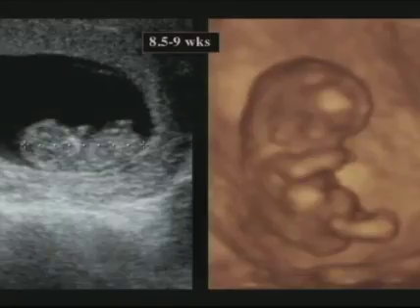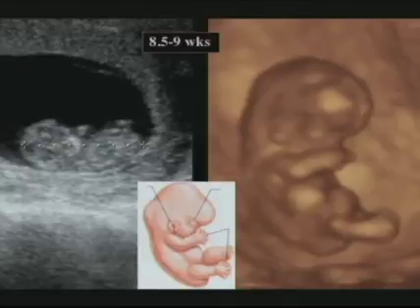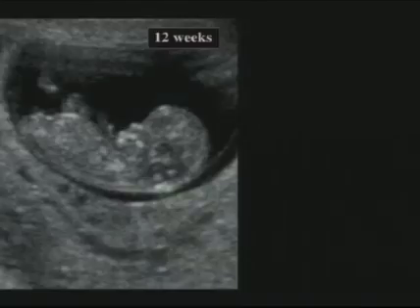Now here we have at 8.5 to 9 weeks, you can already see the enhancement that you get by doing a 3D surface rendering compared to a standard 2D crown rump image. You can see the fetal ear, you can see the little arm and leg buds much better than you can in 2D. And you already get an idea of what this embryo looks like. And you can compare that to the drawing, showing that the ear is actually fairly low at this stage, which is normal, and the ear eventually rises up to be about at the level of the orbit.